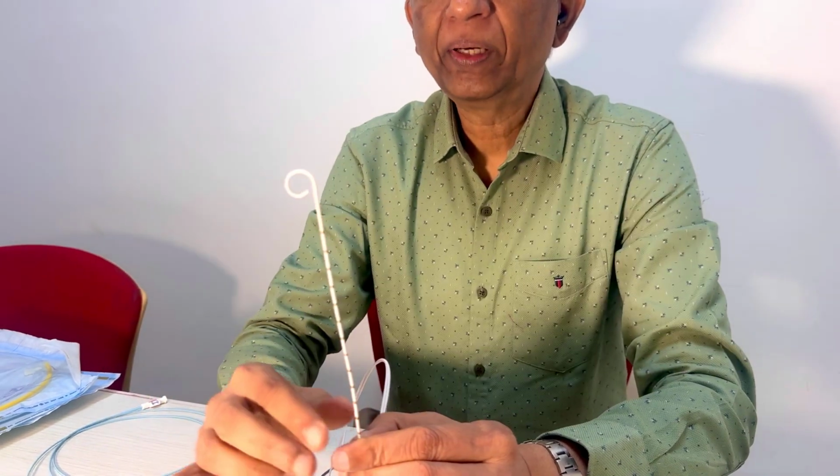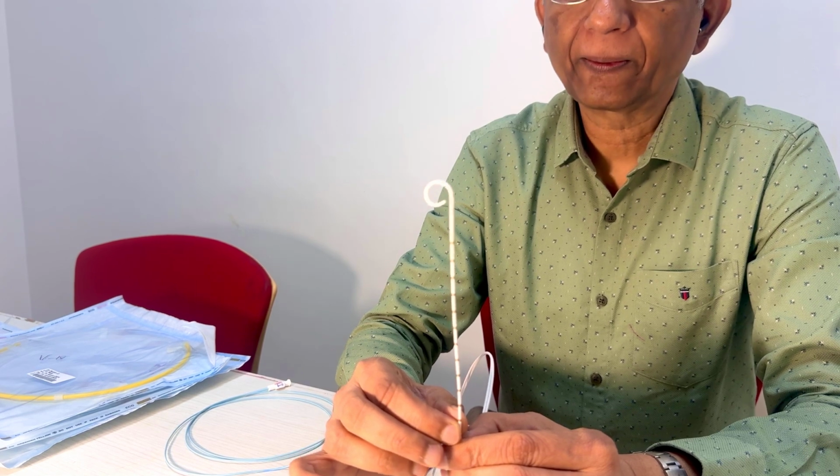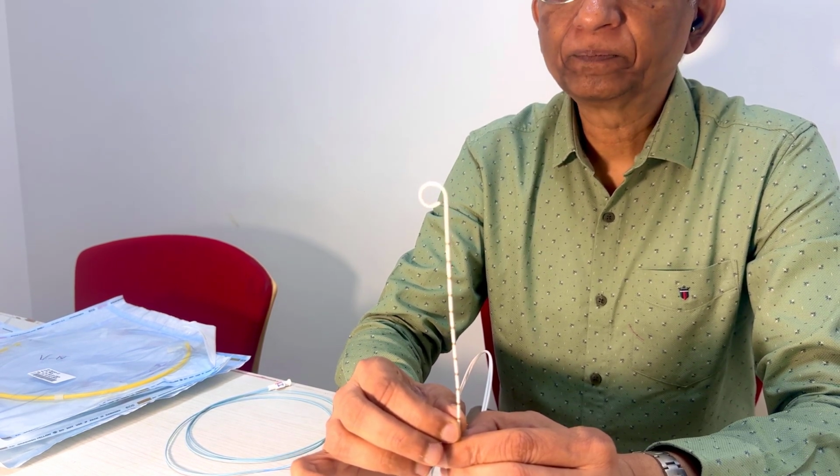But this is an interesting pigtail catheter because it's got metal markers. These metal markers are set 1 centimeter apart. So it is a pigtail catheter, but also it is a catheter that can be used for measuring. So where would you like to measure?